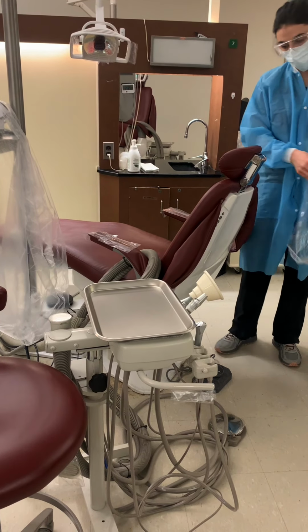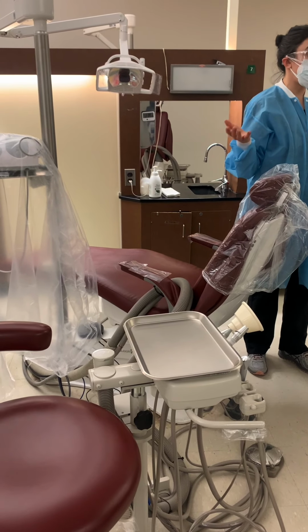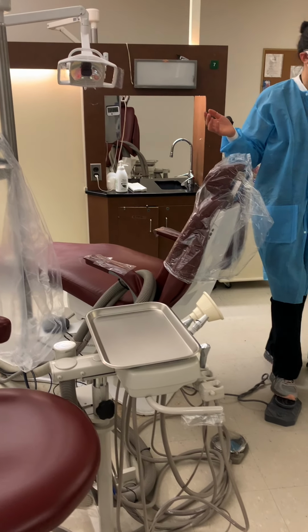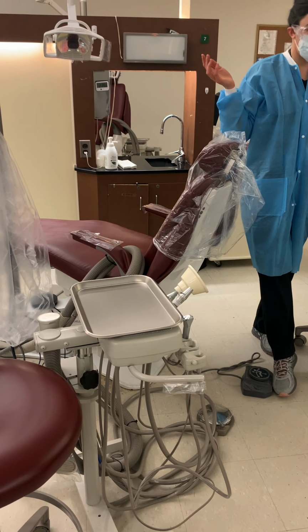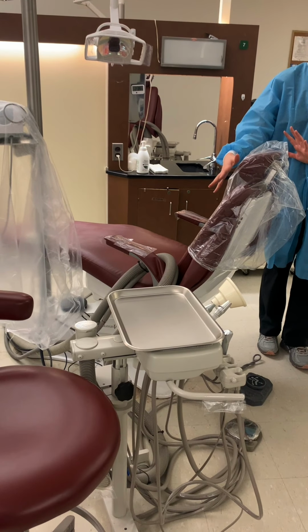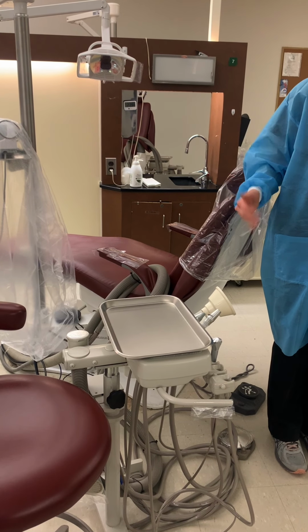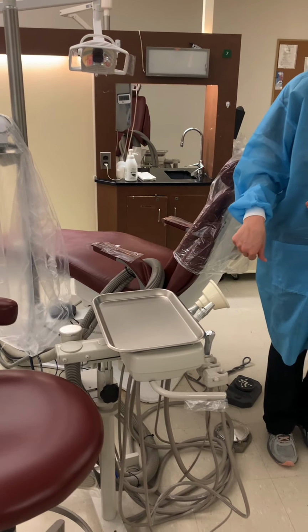What this also does is barriers here. So if you were to use the chair controls to operate the chair from here, you're barriered. But there's another way to operate the chair too, and that's your foot pedal. So it just depends on what your dentist and yourself prefer. So that's how you would barrier this. Your individual pieces here, I'm going to bring my tray over and we're going to barrier these pieces as well.